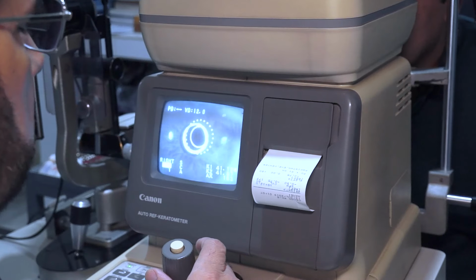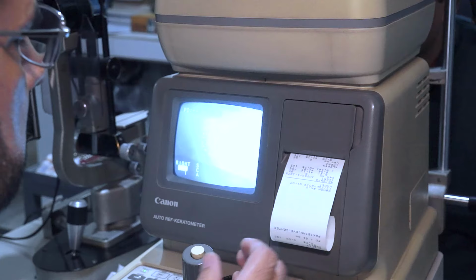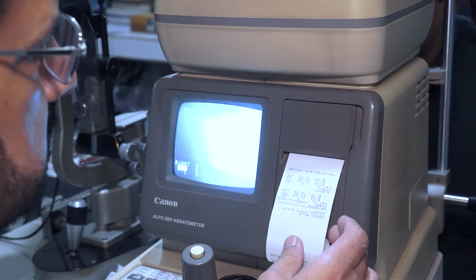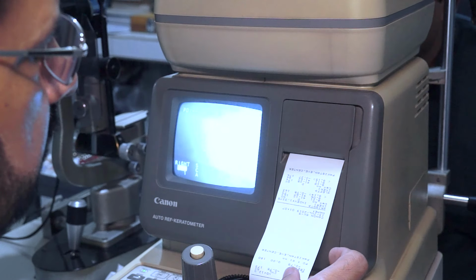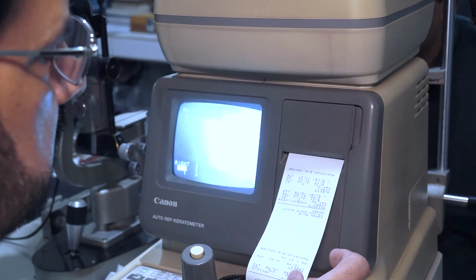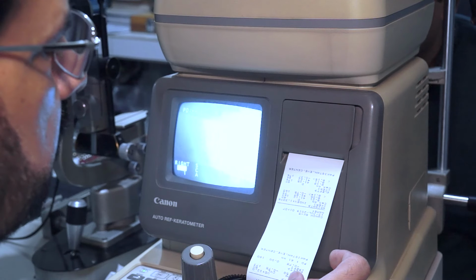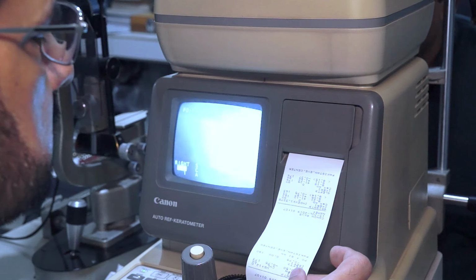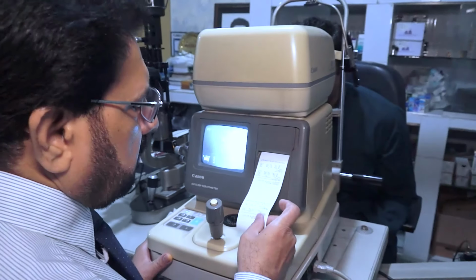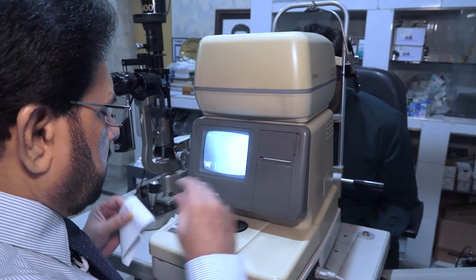Now we have done the keratometry of both the eyes, that is the corneal power, which is about 41 in two different meridians. In the right there is 41.12 in K1 and K2, in the other 90 degrees it is 41.87, and 41.25 and 41.62 in the left. So this is called a K reading or keratometric reading. This is the corneal power.